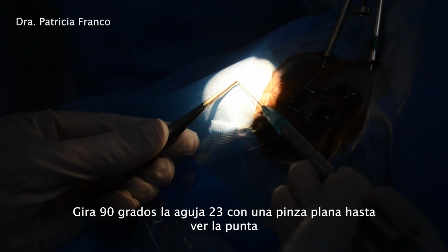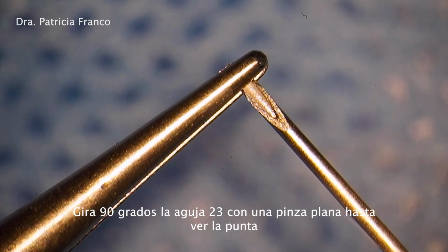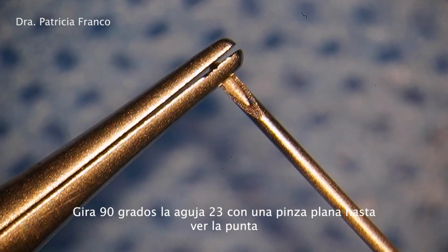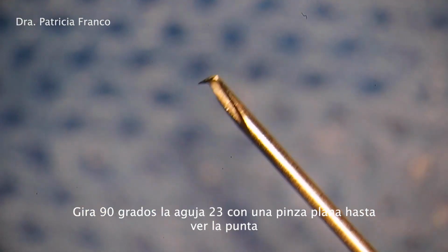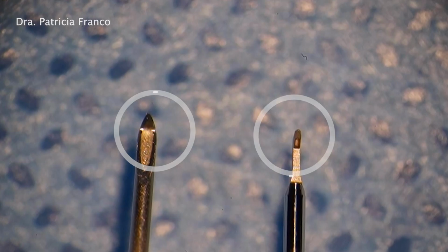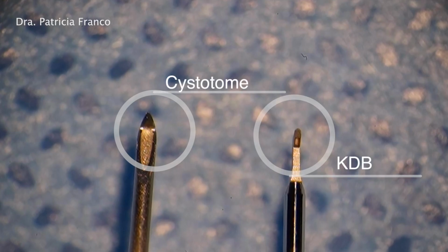To prepare the cystotome, use the microscope and turn the tip of the 23 gauge needle 90 degrees with a flat forceps until you see the tip of the needle. This is a size and shape comparison of both the cystotome and the KDB.